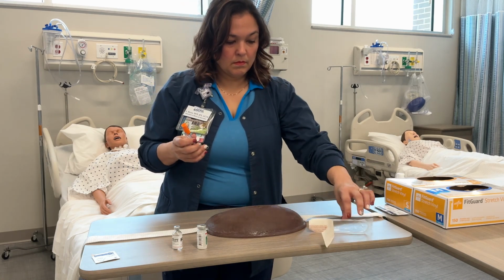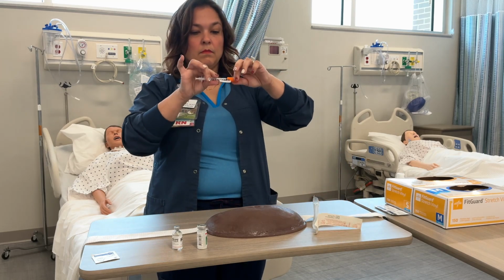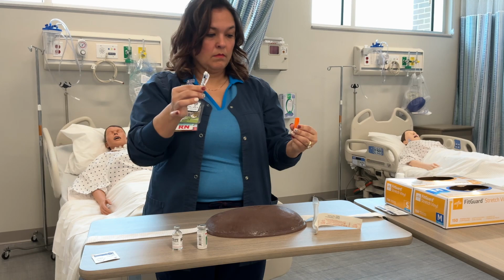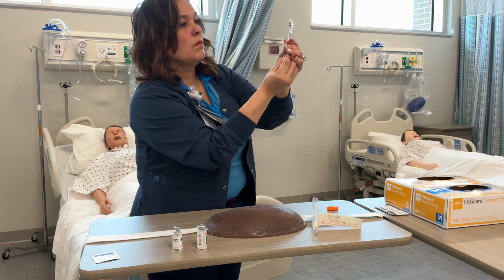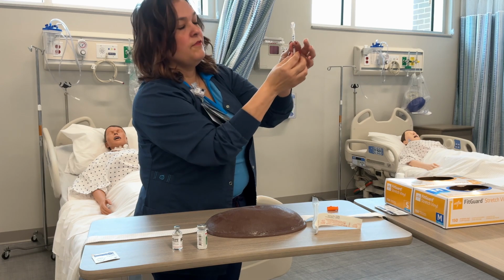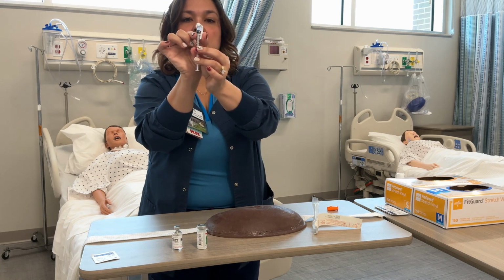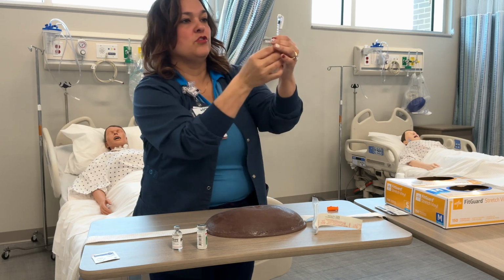Okay, so this is clear to cloudy, so we're going to inject air into our cloudy first, okay? So we're going to give 10 of each. So Ms. Reyes is going to pull back 10 units and inject 10. If you see that this clip is in your way, you can just swivel it so that you can see your numbers better.